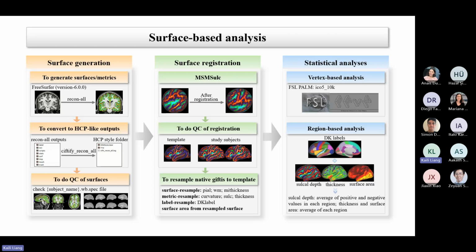But FastSurfer, is it for adults or children's data, and what data size? I don't know. All I know is that I watched a 15-minute presentation by the PI and haven't read the paper. I think it's got problems, but there's no denying that everybody knows learning-based tissue segmentation is better than classical pipelines by now.